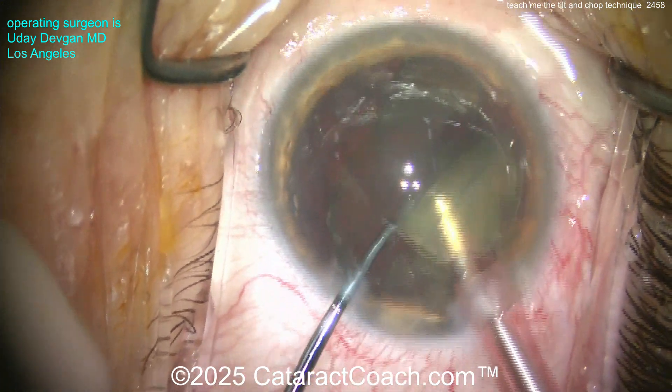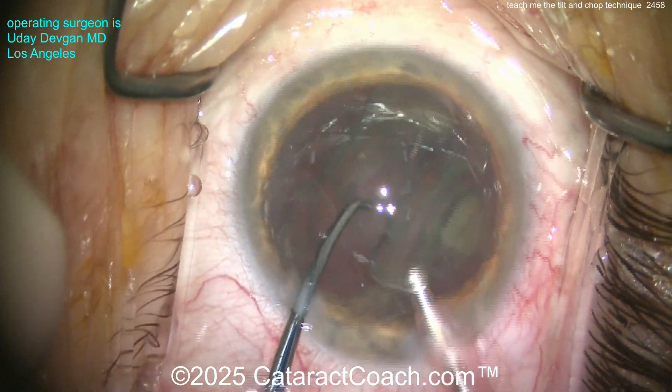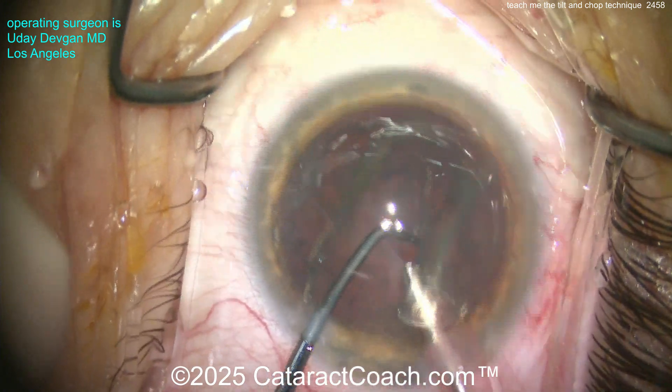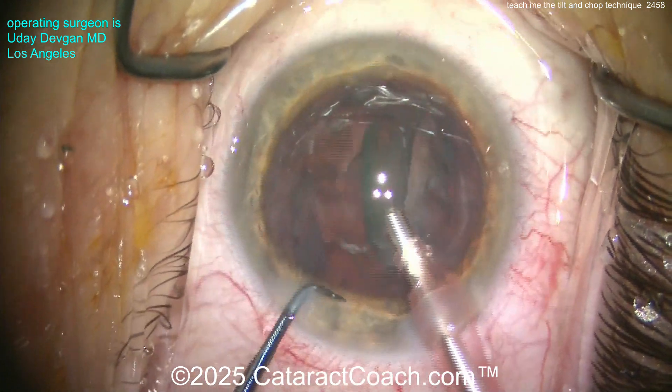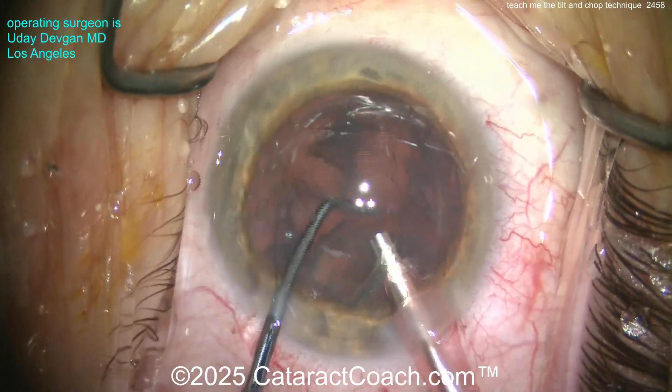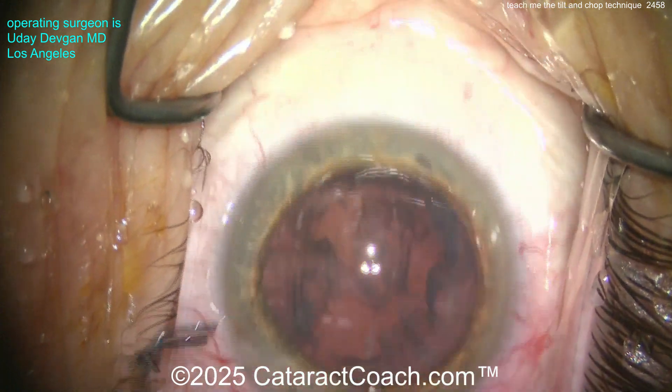Now emulsifying the cataract very easily. I've got a high flow setting here — about 40 to 45 cc's a minute of fluid flow, high vacuum 500 millimeters of mercury — and doing a little bit of phaco power modulation. Nice and controlled removal. Look at the chopper in the safe position, just to protect the bag.